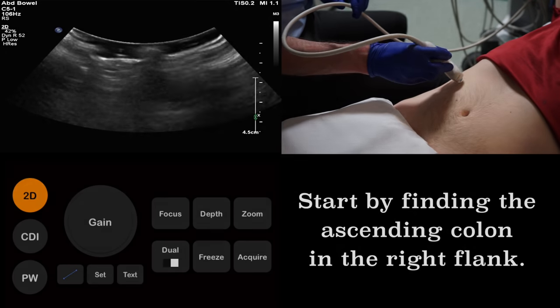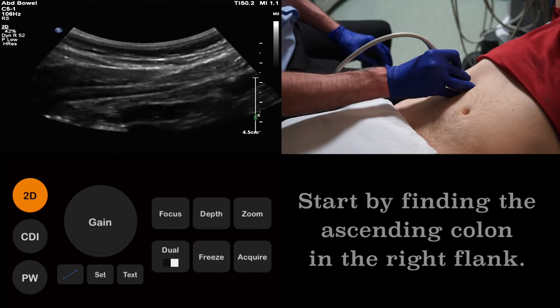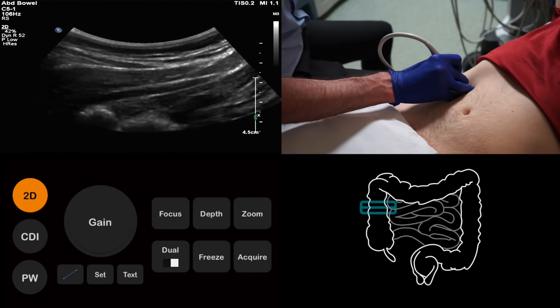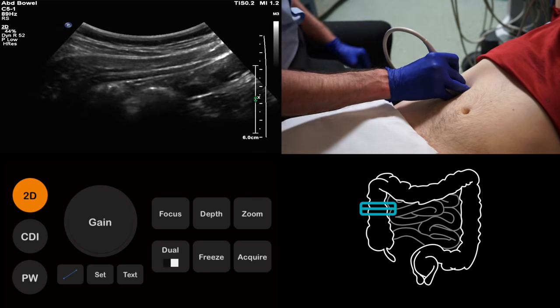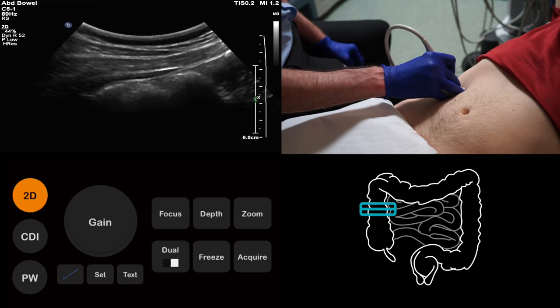Although the appendix is located in the right iliac fossa, we start with a probe in the right flank. This is because we need to define the local anatomy before we head for the appendix. Our first task is to identify the ascending colon. If we can find this structure, then we can scan inferiorly to locate the cecum, from which we know the appendix will arise.